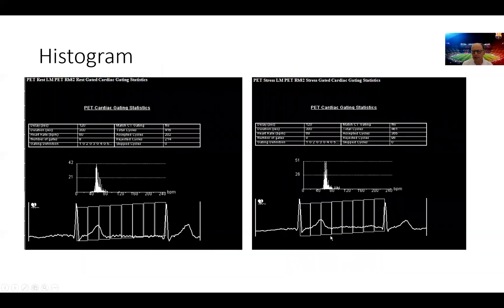The next stop is to make sure we ascertain that we acquired the gated images properly within a reasonable histogram. These are the histogram for the gated images during the rest images where the heart rate was 60, and this is during the stress images where the average heart rate was 68. Again, this is a very narrow histogram indicating that the patient was in regular rhythm or in a controlled rhythm with no extra ectopy or variability in heart rate.